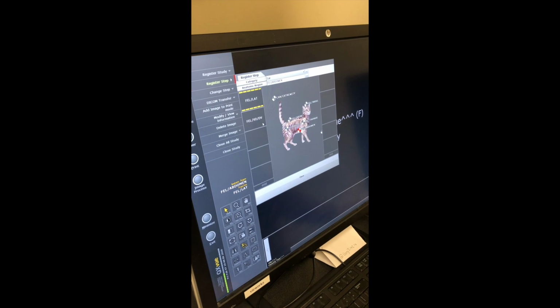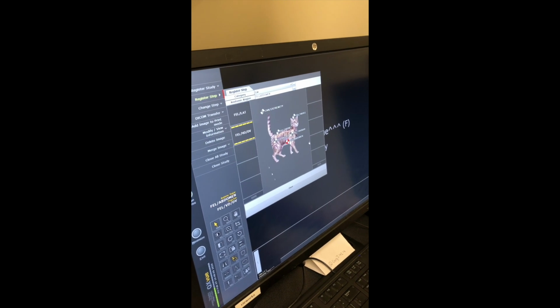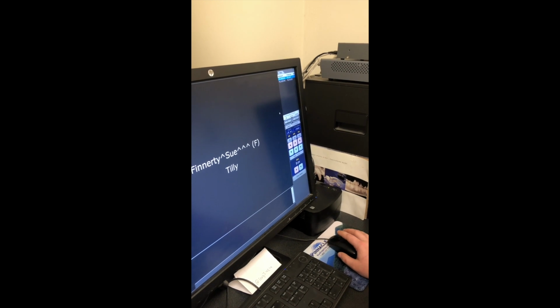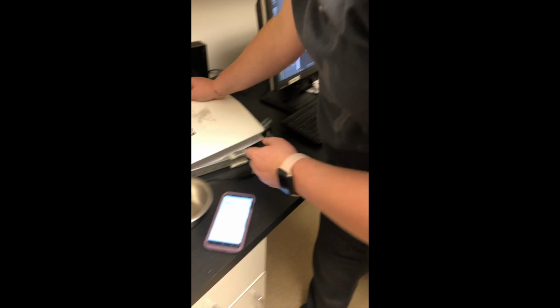Water-soluble organic iodides are preferred when bowel perforation is suspected. This agent readily mixes with blood and other bodily fluids and can be excreted through the kidneys. It has a rapid transit time and is non-irritating but has a bitter taste and is more expensive.